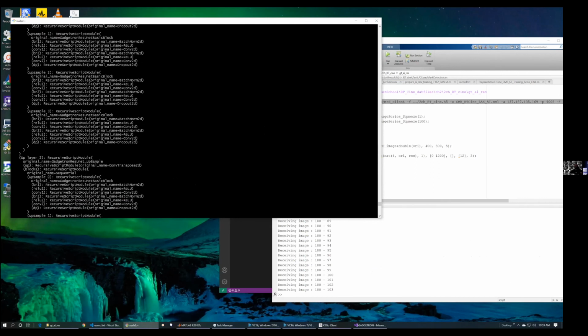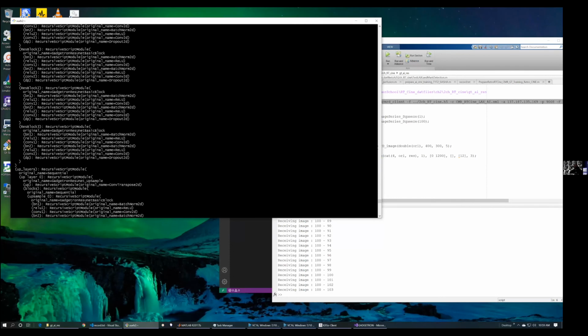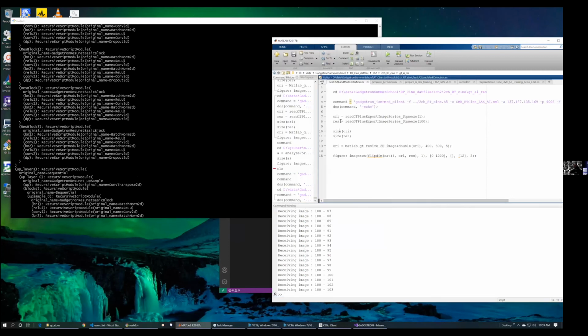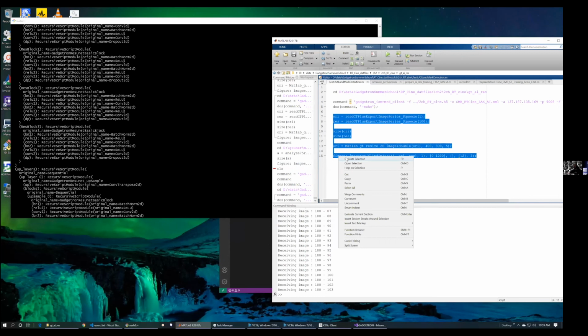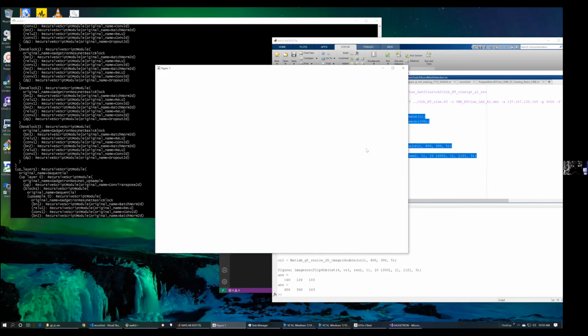This is printed this model. You can see it's including lots of batch norm ReLU convolution layers. Then I have a few functions which we will load. The original series image is in series 1. The series with landmark overlay is on 100. So I will load them and plot them as a movie so we can see how this model performs.